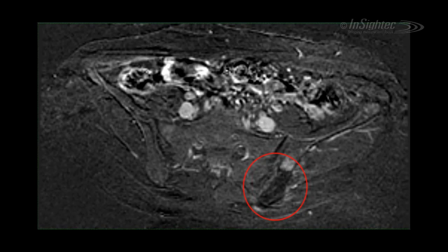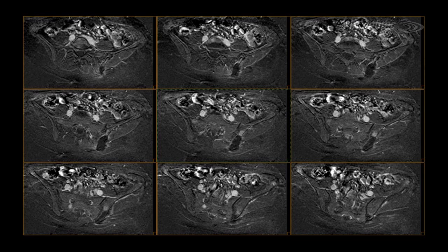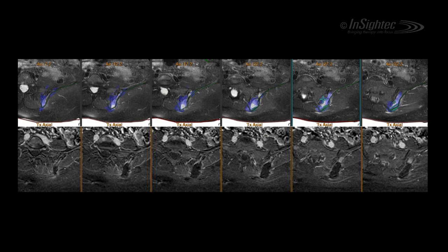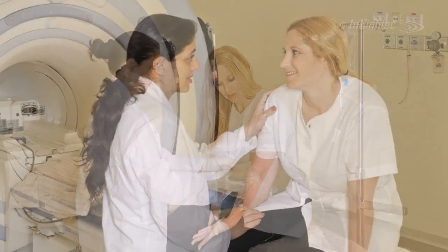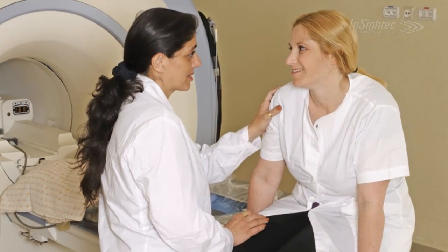Post-treatment contrast-enhanced MR images enable the physician to verify the immediate treatment effects by depicting the ablated region. After treatment, the patient is observed for two to three hours and then released according to site standards.